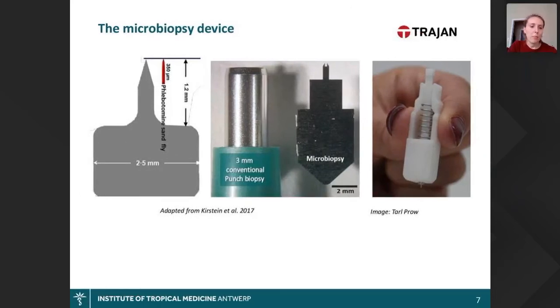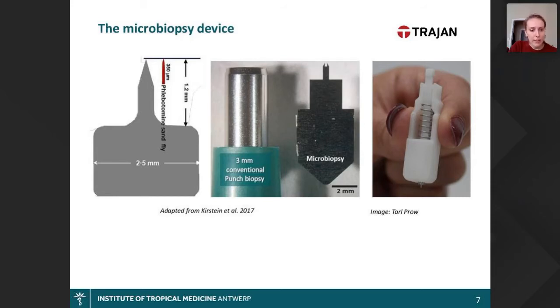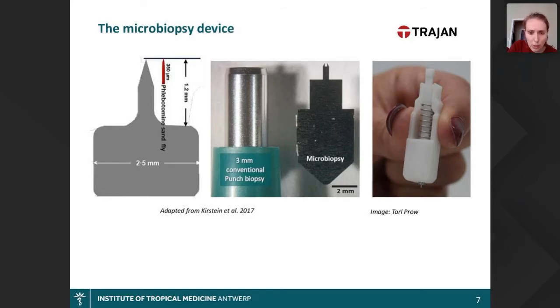That's why we started looking at the microbiopsy device. It's manufactured by Trajan in collaboration with several Australian universities and it mimics the sand fly bite — it goes relatively superficial and captures a combination of cells and blood. As you can see, compared to a conventional punch biopsy it's very small. There is a tiny lancet which goes into the skin when you flick the plunger.